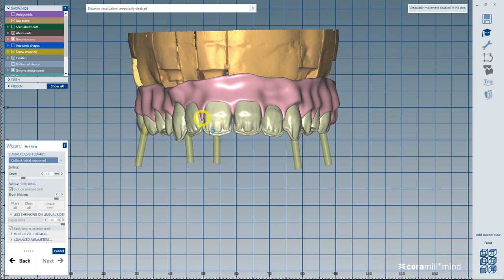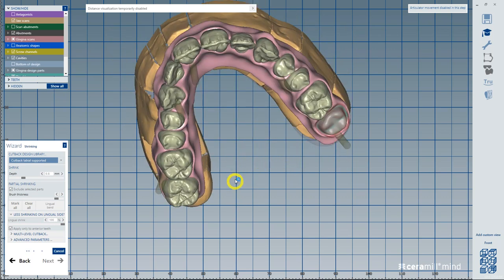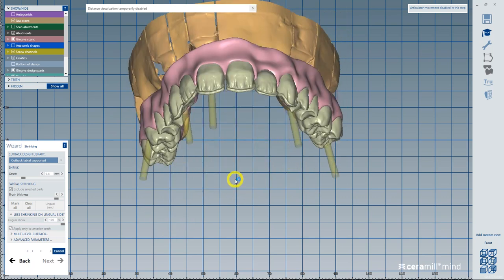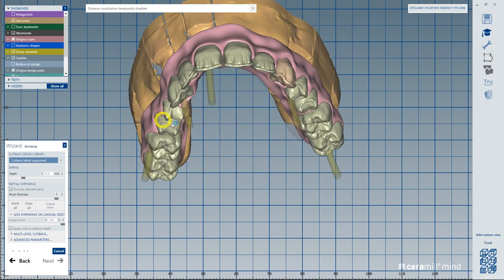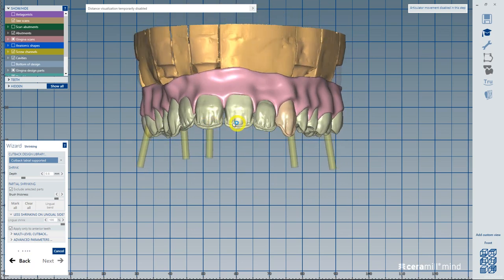So as you see now, I have the cutback here. I have the full contour in the posterior. My bicuspids, I can add porcelain for a full layering. But this right here, I can tell you this is a really, really nice restoration once you lay some enamel in there and have that color in the background. So we'll let it finish.